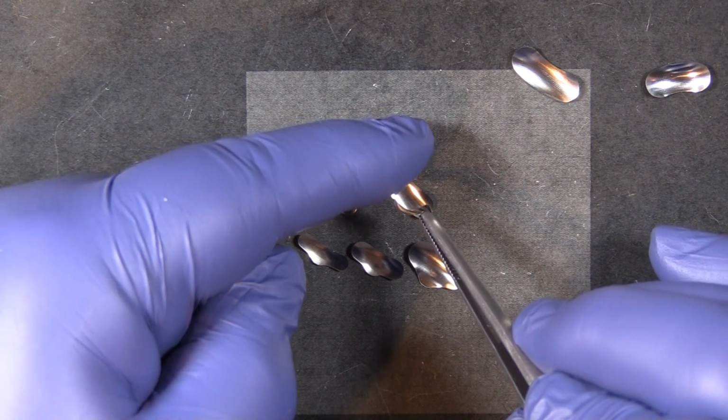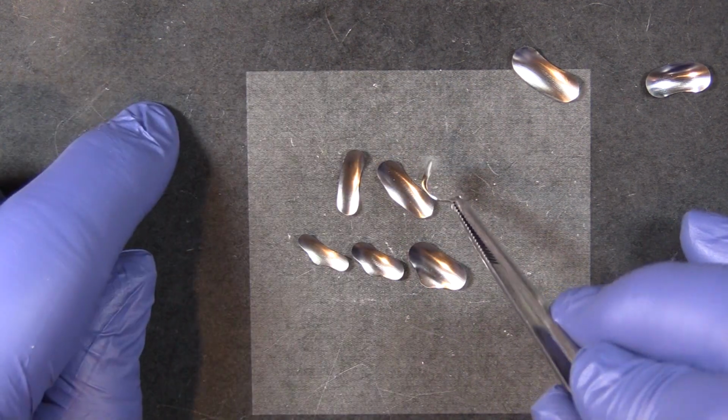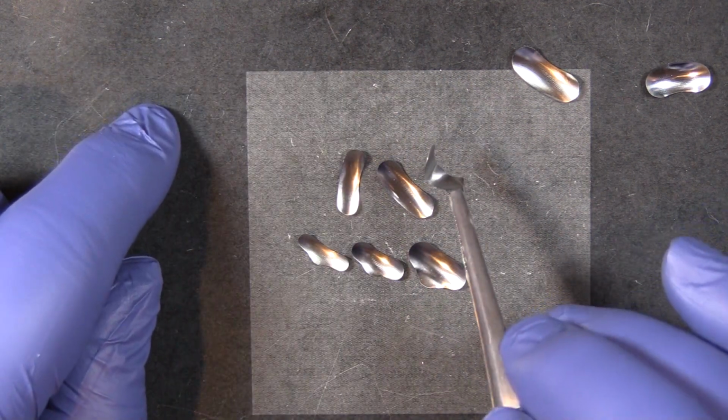And once it's in place, make sure the ends of the band are nicely up against the tooth out of the way before you place your ring.